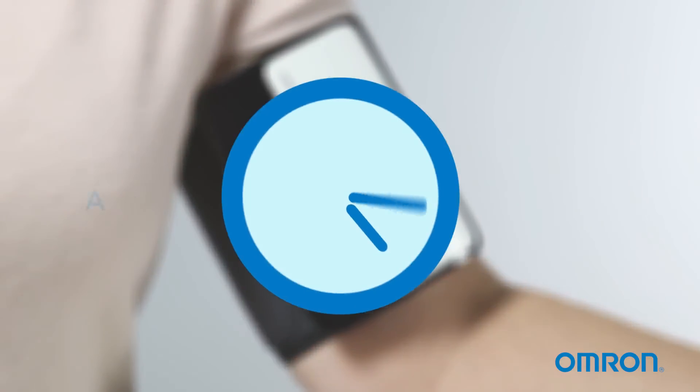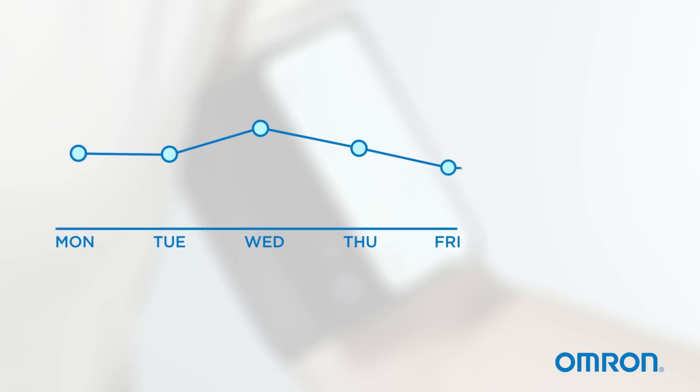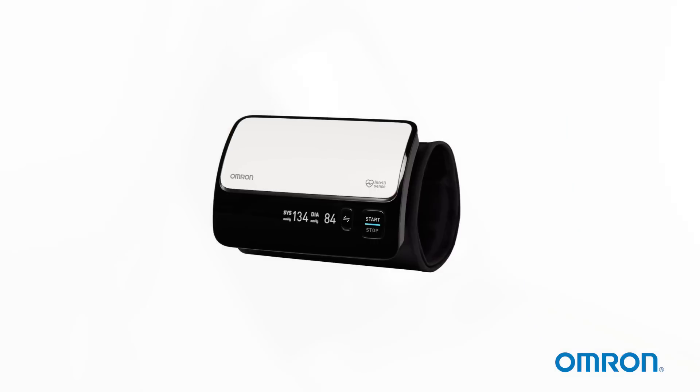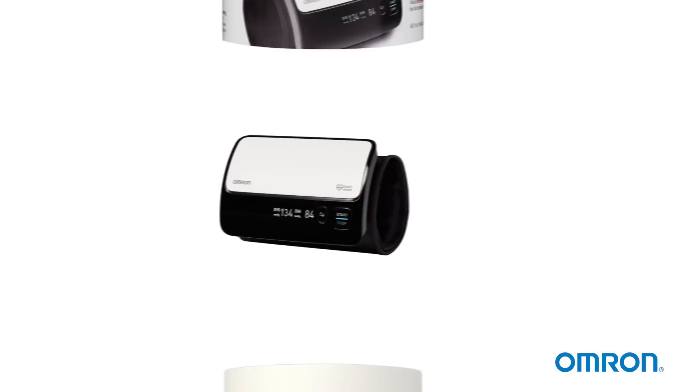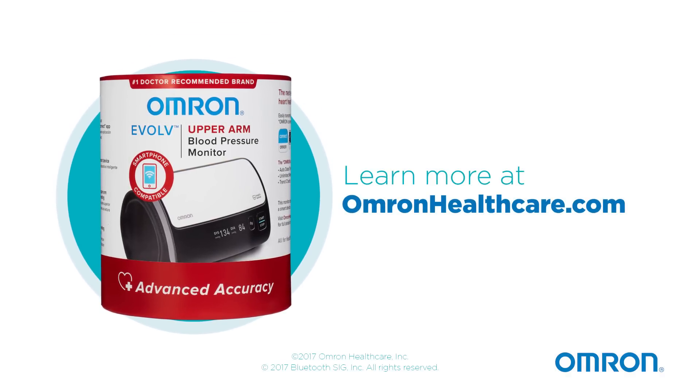It's important to take measurements at the same time each day and use averages over time to compare your readings. Be sure to follow all instructions provided with your Evolve upper arm blood pressure monitor. Learn more at OmronHealthcare.com.